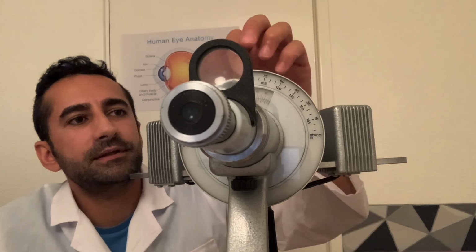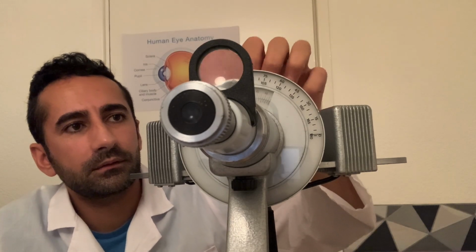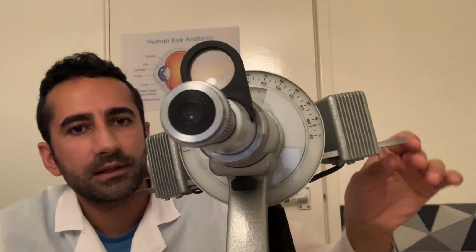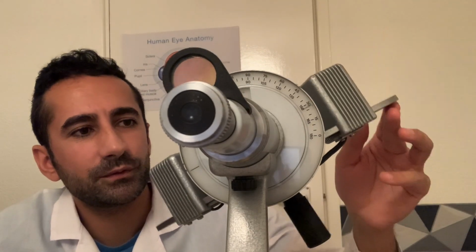Welcome to your assessment. Today I have a special piece of equipment to show you. We have the keratometer. This piece of equipment is used for checking the curvature of the cornea.